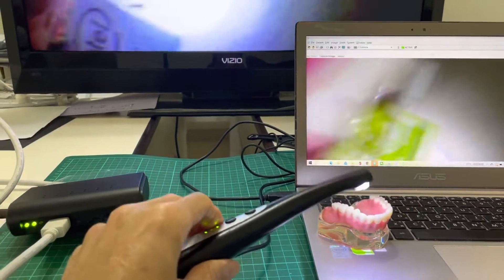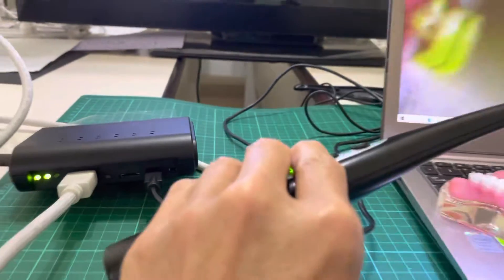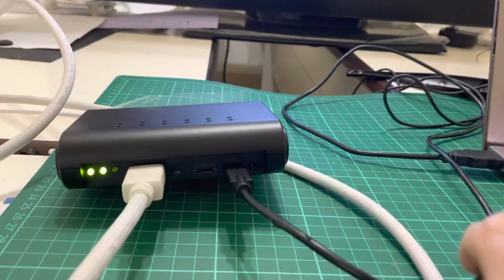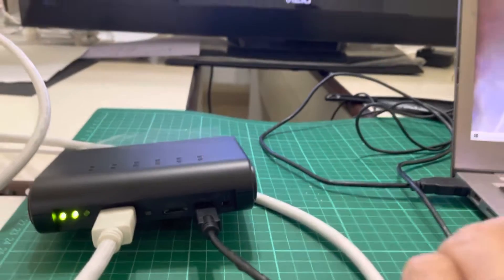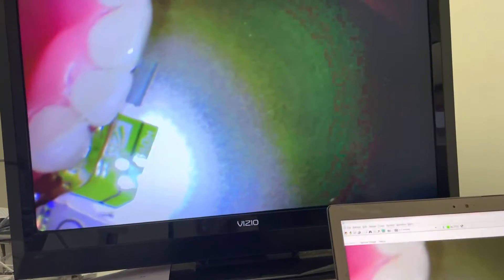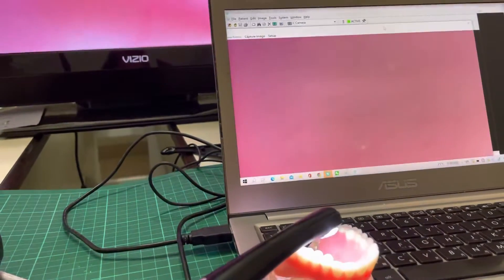So this is the receiver box. On the receiver box, there are HDMI output and USB output. The HDMI output can go to the bigger LCD monitor, and the USB port can go to the PC here.